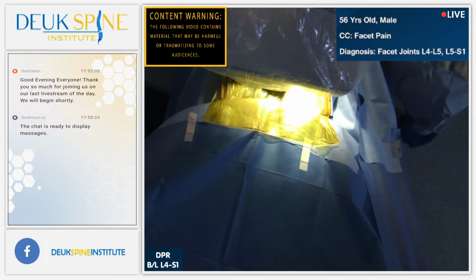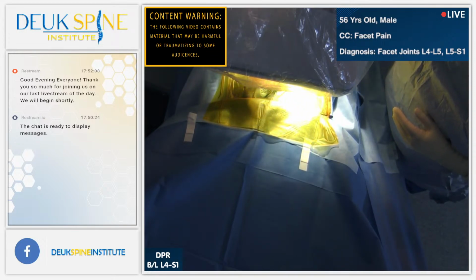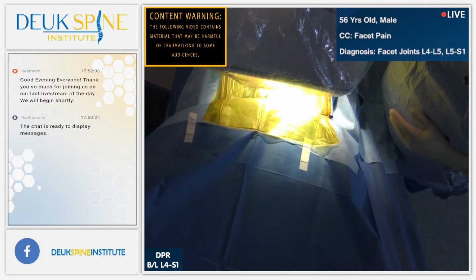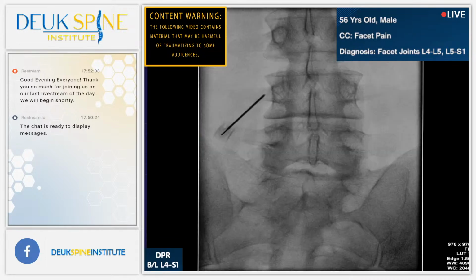We are performing a procedure called a rhizotomy in a patient's lumbar spine. He has back pain coming from his facet joints, and the facet joints that are hurting him are specifically the L4-5, L5-S1 on both sides, and we are going to be treating them right now with what's called a rhizotomy, specifically a Deuk plasma rhizotomy, which is a new kind of rhizotomy we're doing that is more permanent and gives more permanent pain relief.